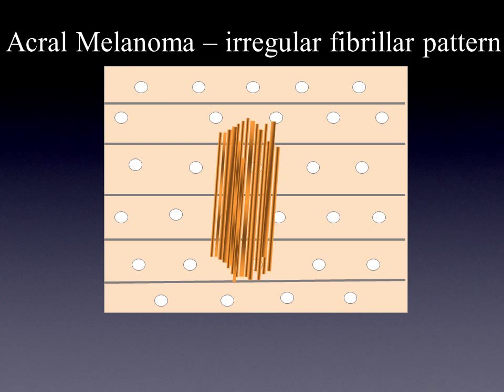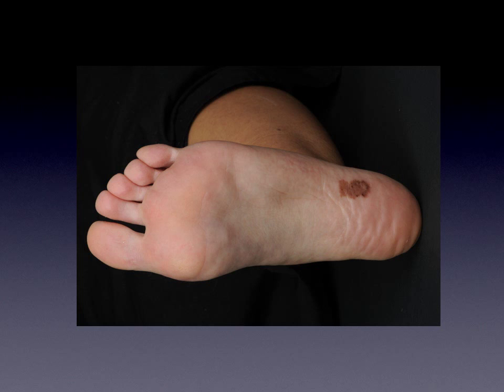The irregular fibrillar pattern is another pattern frequently found in acral melanomas. In this pattern, the lines crossing the furrows and ridges are irregularly pigmented and show a great variety in thickness. Here you see an example of a large macule on the sole where in dermoscopy this fibrillar pattern crosses in an irregular way the furrows and the ridges. At larger magnification you can see more clearly the irregularity in color and in the thickness of the fibrils.